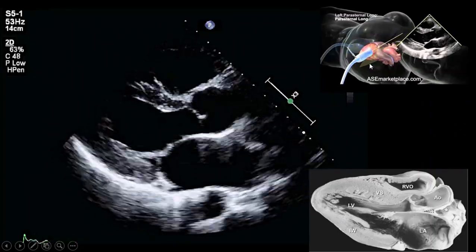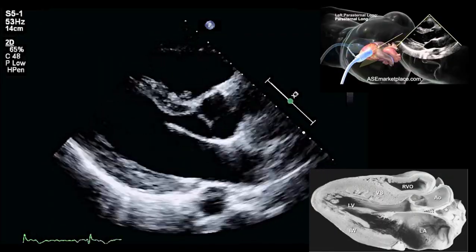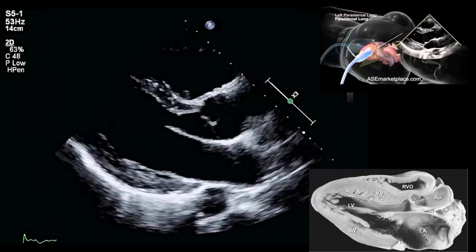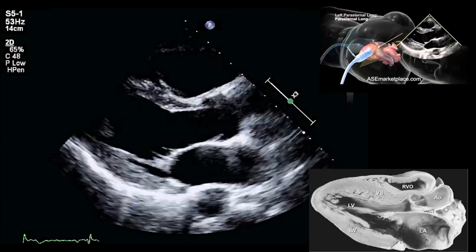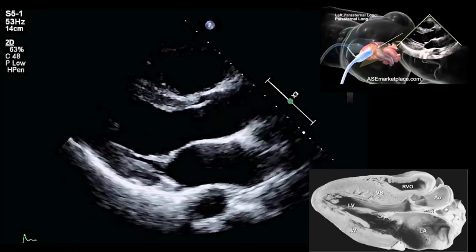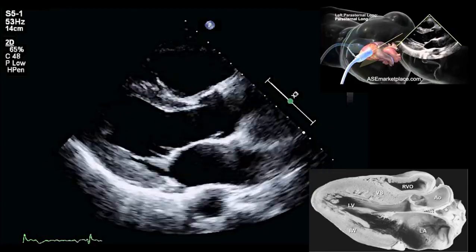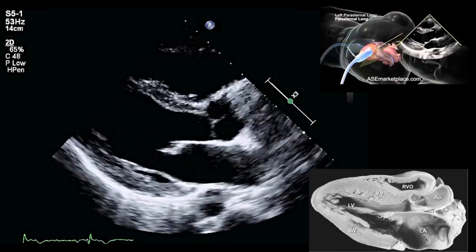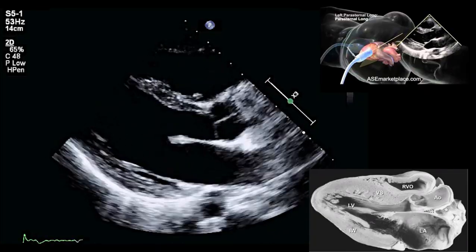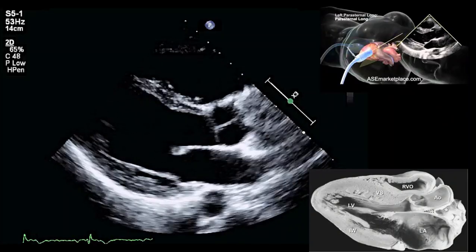We start with that spot, but as a good technique, finding the best window for the PLAX view is searching circular, clockwise or counterclockwise, it doesn't matter. And with this maneuver, when we find the spot that has the best penetration of the sound to the heart, less noise, and the best quality of image, then from that point with maneuvers, heel-toe, rotation, fanning, all those maneuvers with the probe that I talked about in another presentation, we fix our image.